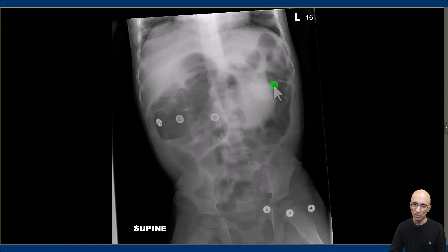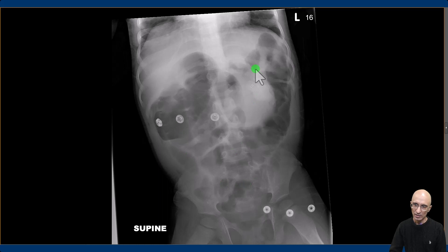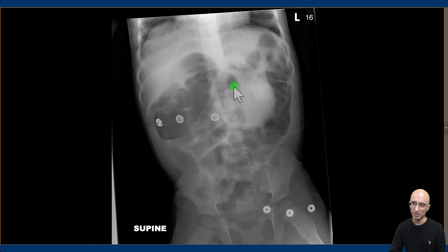On the abdominal radiograph, we can identify the percutaneous gastrostomy tube. Immediately adjacent to that, we can see a large soft tissue density lesion. There are multiple gas-filled dilated bowel loops. The soft tissue density lesion was indeterminate and the patient subsequently underwent ultrasound examination.